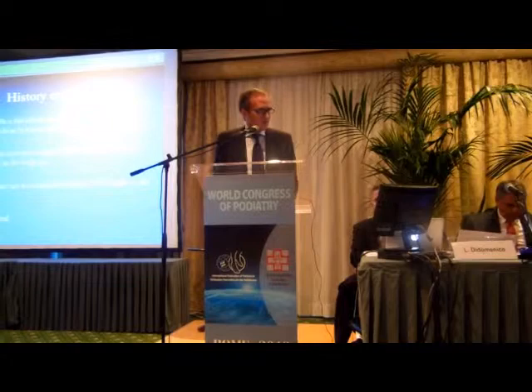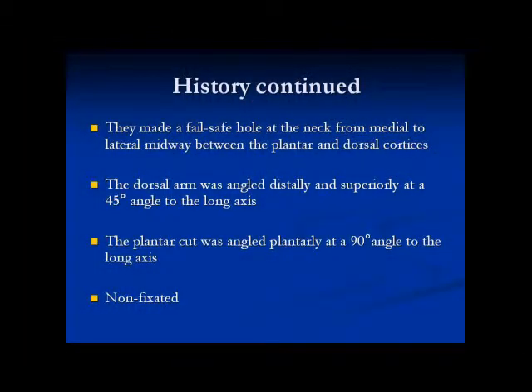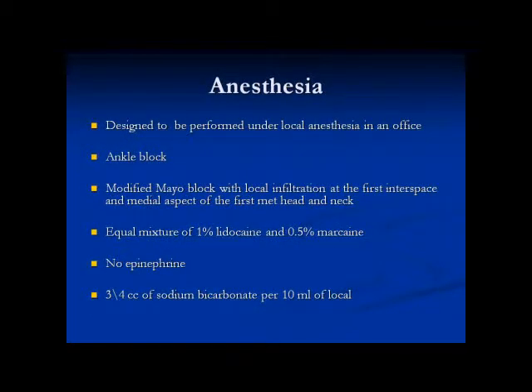They made a fail-safe hole at the neck of the metatarsal to start the osteotomy, and we'll skip a couple of these. It's designed to be performed under local anesthesia in the office. You can do it with an ankle block or with local infiltration and a modified Mayo block.